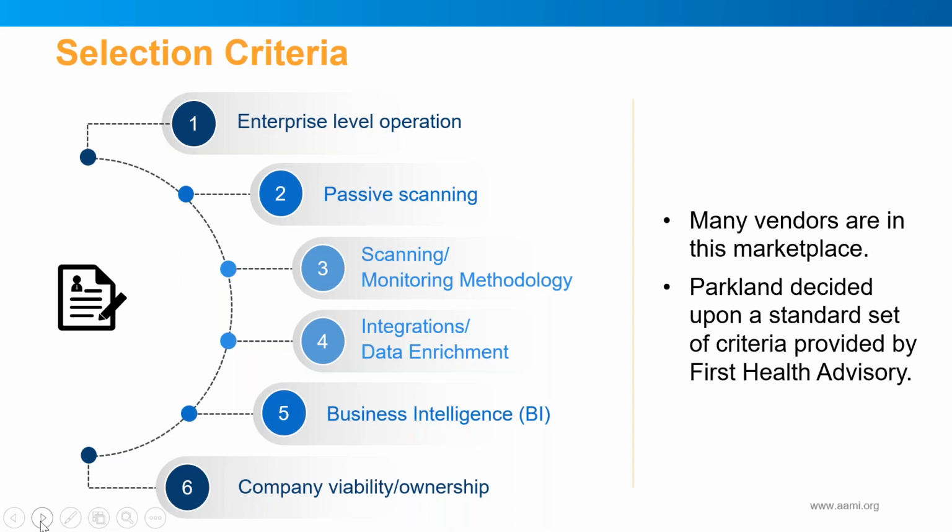Another one is integrations. With these devices, you want them to be able to integrate with existing security and HTM tools that will allow every section to get their job done and get the most value out of it. You don't want a flathead screwdriver that's only good as a flathead screwdriver. You want a tool that's going to be able to do multiple things and tie into other systems. So it may also provide data enrichment information to your CMMS, and it can also provide alerts and vulnerabilities to your security operations center folks.